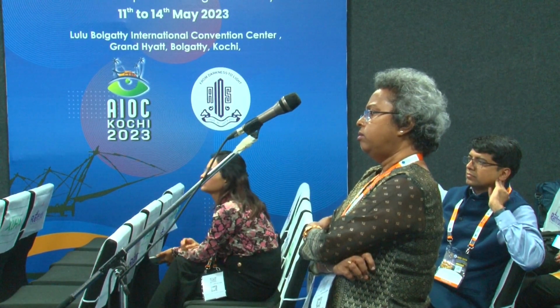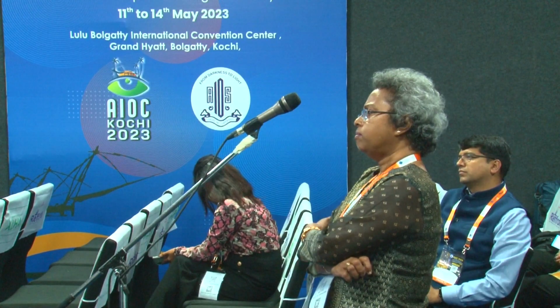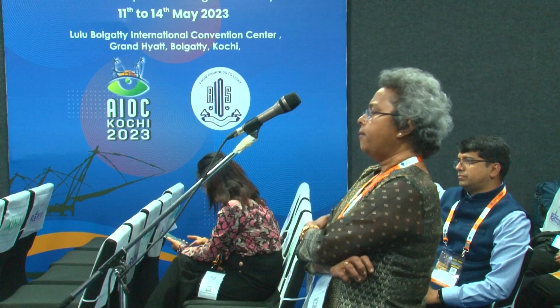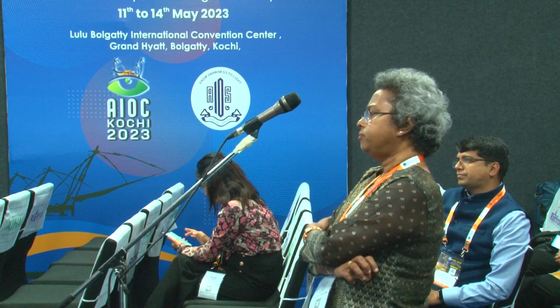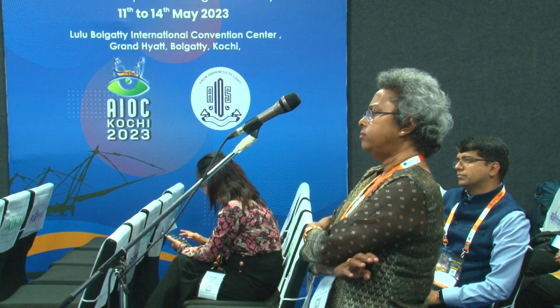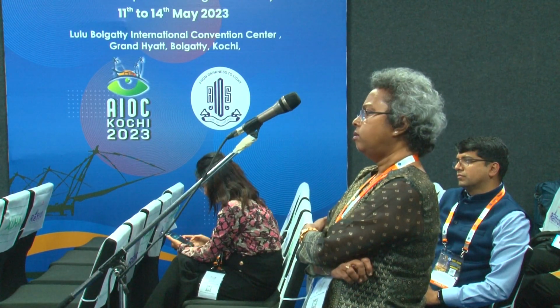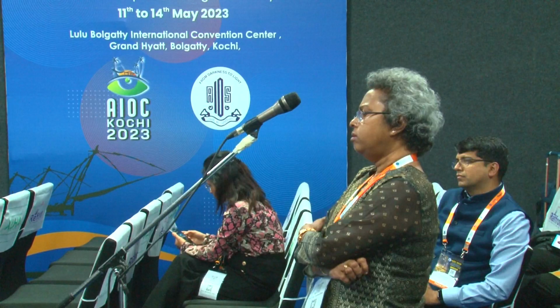Personally, I won't recommend that. I'll only prefer to do a Descemetopexy with an air bubble, because there the anterior part of the cornea is normal. Why we are doing this procedure in these patients is because the anterior part of the cornea is biomechanically not normal. So just pushing it against with the air bubble, or with SF6 and C3F8, does not logically make sense for these cases. Whereas there, when the cornea is normal post cataract surgery, the stroma is normal.